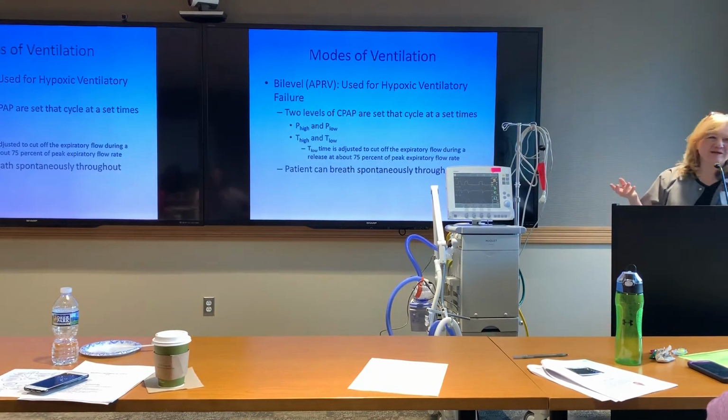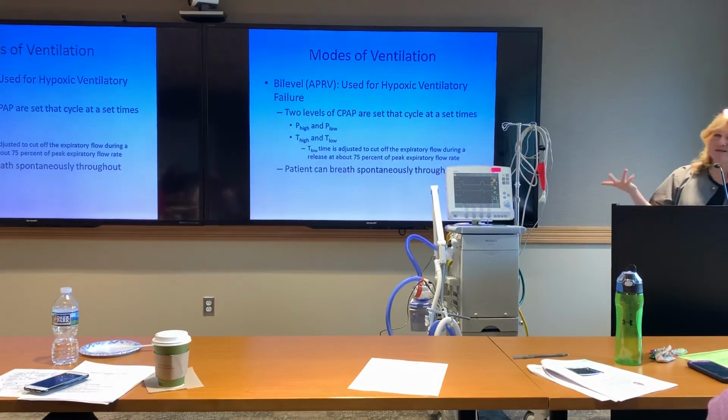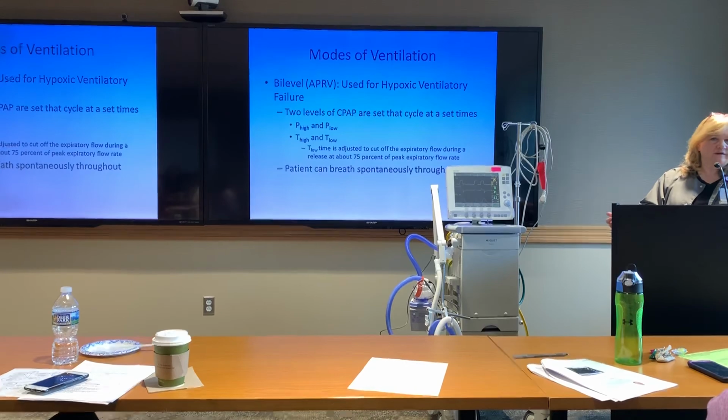Bi-level. Do you guys use bi-level in NSIC? If Dr. Who? Dr. Denani. Really? Because it's primarily used for people who have hypoxic respiratory failure. PF ratio is less than 150. You guys good with PF ratio? Do I have to explain that term? No? Okay. That's typically when you're going to think about it. So that isn't normally your guys' issues.